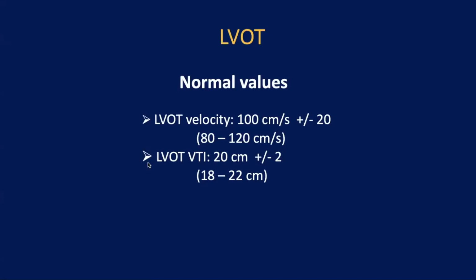So what is elevated? You need to revise it. You need to adjust your place, or it is really, really high. Also, if it is high up to like 1.5, sometimes you cannot use the Bernoulli equation. You need to use the modified Bernoulli, not the simplified that we use. How about the VTI? It's 20 plus minus 2, and people will go from 16 to 23. I have seen some reference.